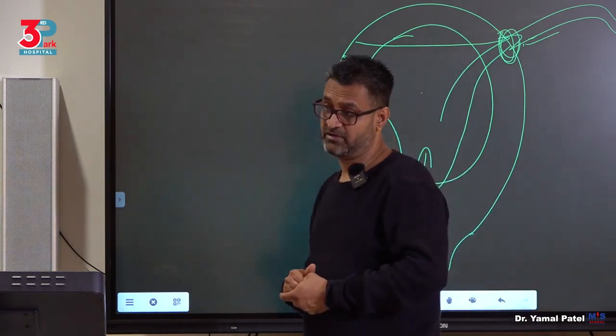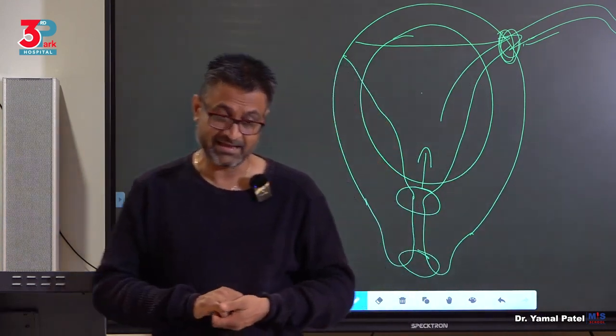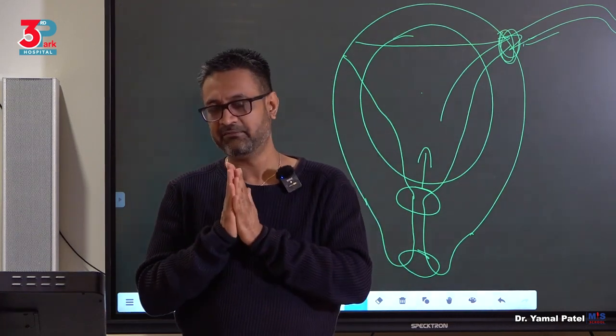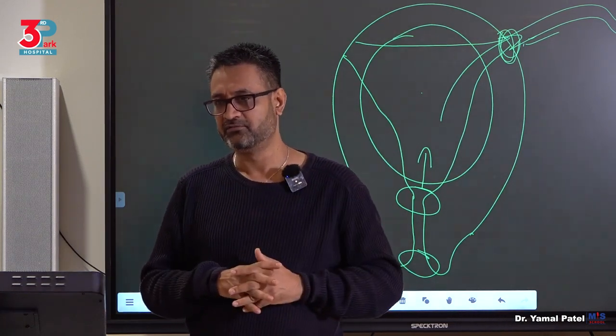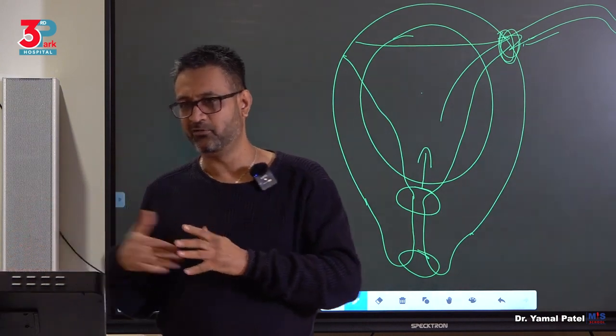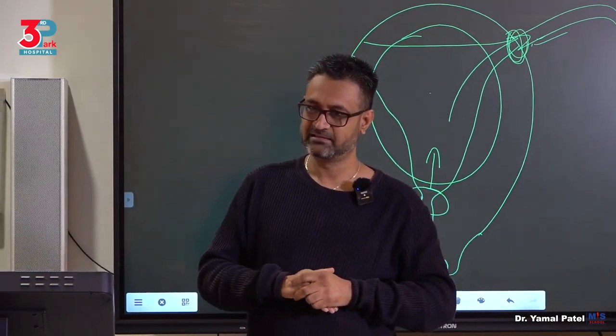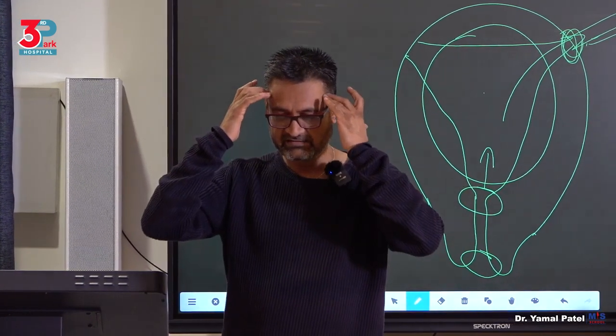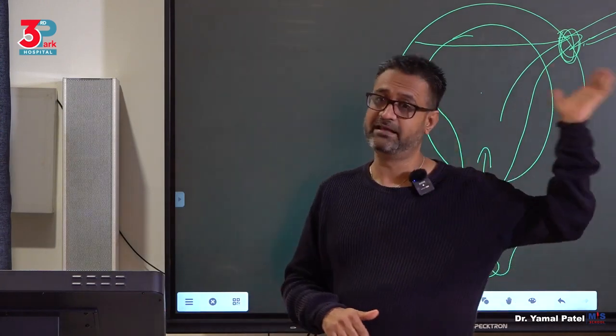When you have hypotonic, then you absorb that fluid, you can have a very big problem of fluid overload, yes, but also of electrolyte imbalance, okay? And it can therefore cause lots of other challenges like cerebral edema, convulsions, including death.